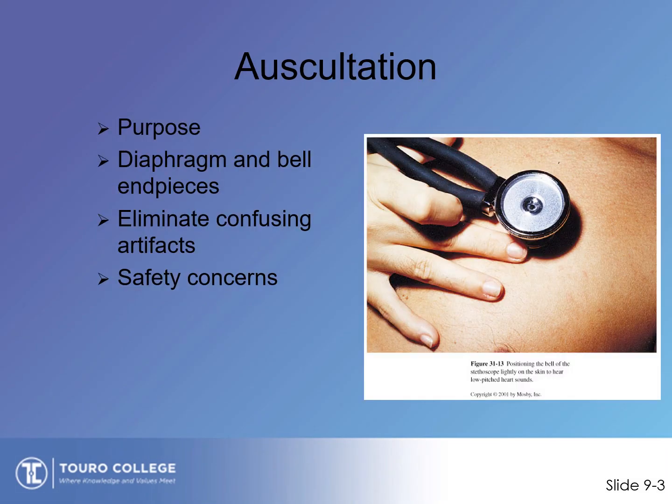Auscultation. It's listening to the sounds produced by the body. We use a stethoscope to listen to breath, heart, and bowel sounds. And I really believe that you should invest in a high quality stethoscope. I like Littmann.